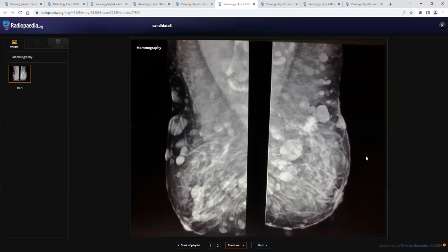Okay. So what is a one-stop clinic? It's basically for the evaluation of breast lesions, and there they do the clinical examination as well as ultrasound of the lesion, and also refer the patient to accelerate the patient's pathway, because if it is highly suspicious for malignancy, they will arrange the biopsy of the lesion as well. Okay, great. Anything else you want to see in this case?